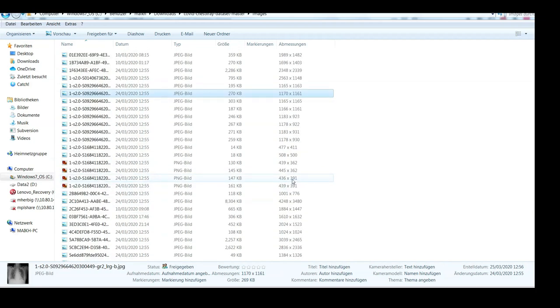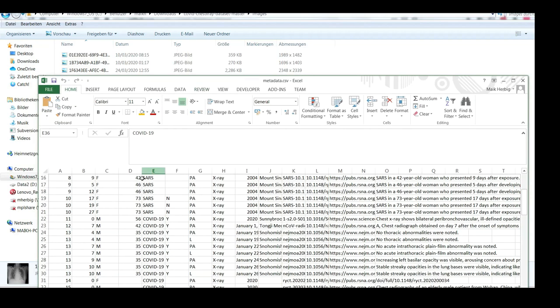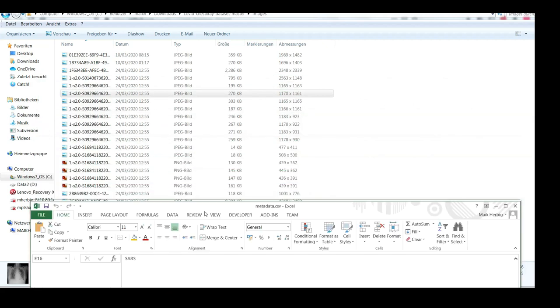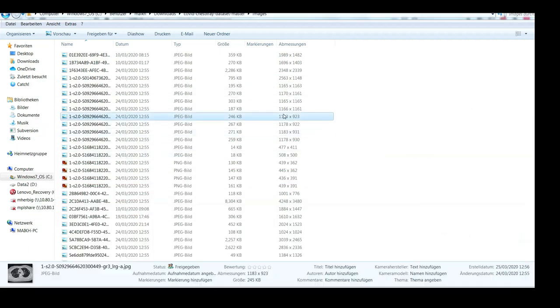One problem that could occur out of practical reasons is that patients where COVID-19 is suspected might have been sent to a particular facility and imaged using a particular machine, while other patients with SARS, for example, might have been measured with a different machine. So it could easily happen that if we train a model using this dataset, it will only learn to detect the differences between different X-ray machines.